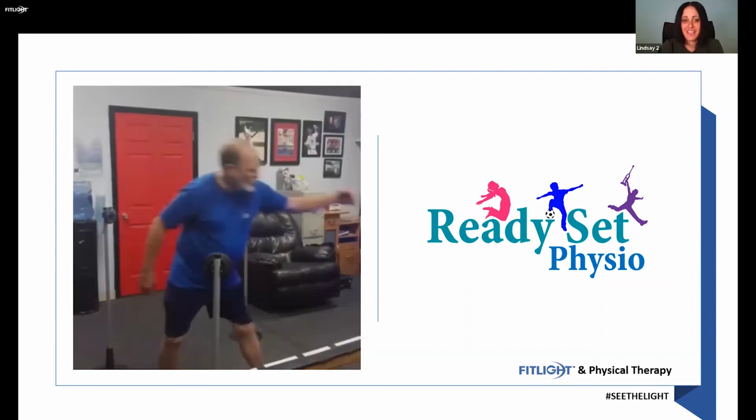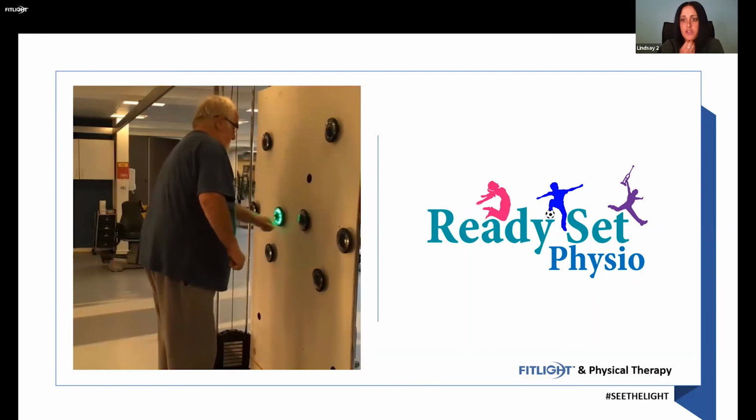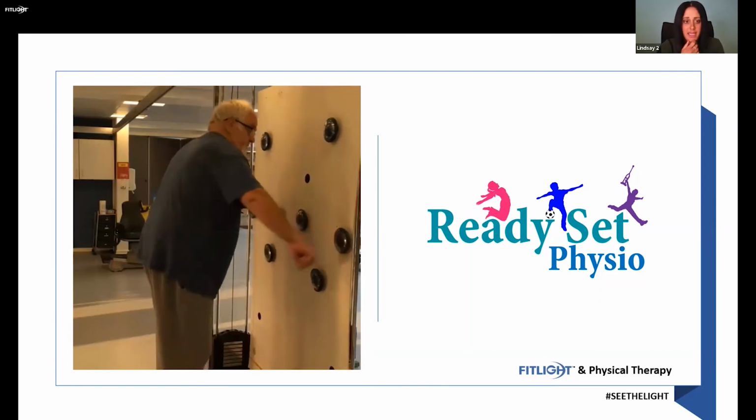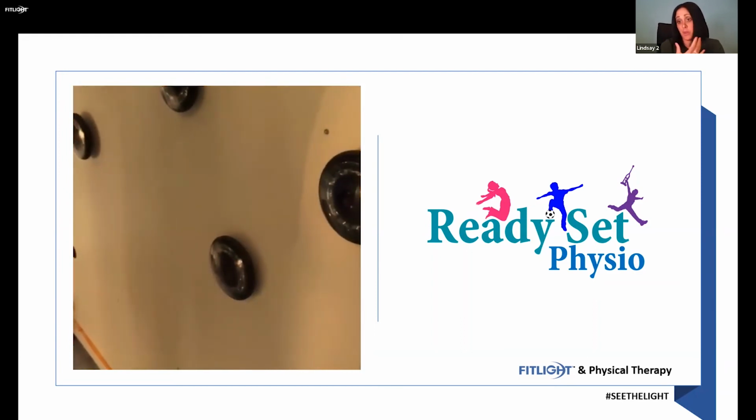Yeah. We actually, I was lucky enough to be part of an outpatient stroke rehab program, and part of the warm up, and most people, I would say 80% were wheelchair bound.